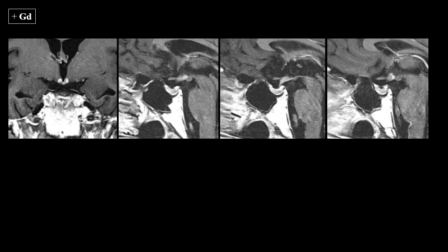Contrast was administered intravenously and the imaging was repeated. On the contrast-enhanced images, you see areas of abnormal enhancement in the regions previously circled. On either side of the walls of the third ventricle in the region of the hypothalamus, there is bilateral abnormal high signal intensity. On the sagittal image, there is thickening and enhancement in the upper pituitary stalk extending up into the hypothalamus. You should not see enhancement in the hypothalamus, although the pituitary stalk itself does enhance, but it is thick in this particular case.